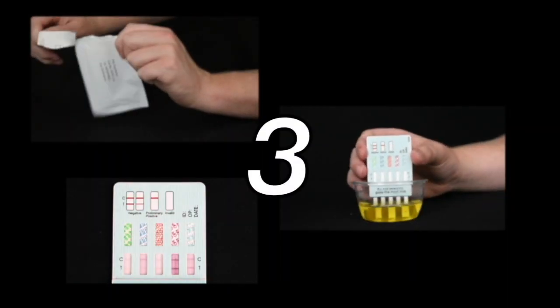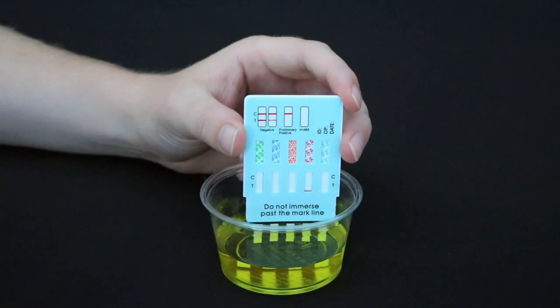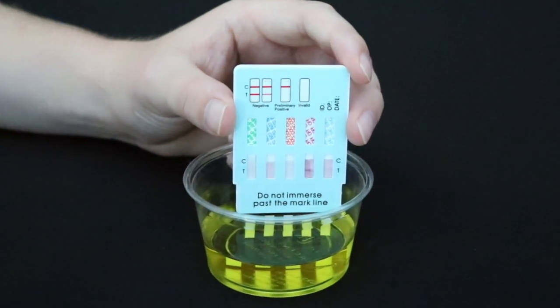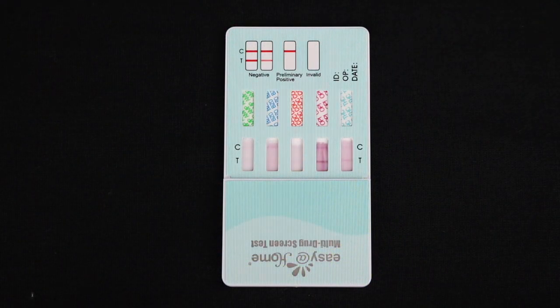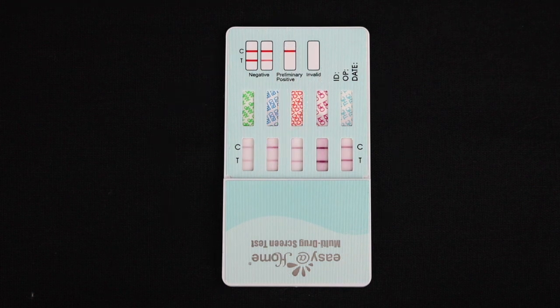Testing is very simple with only three steps. Pull the cap off and immerse the absorbent end in the sample for 10 full seconds. Make sure you don't immerse past the mark line indicated by the black line. Put the cap back on and lay flat on a clean, dry surface. Read results in five minutes and not after, as after five minutes the results may become invalid.